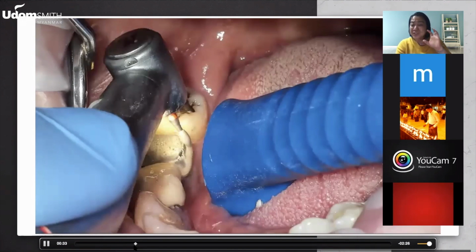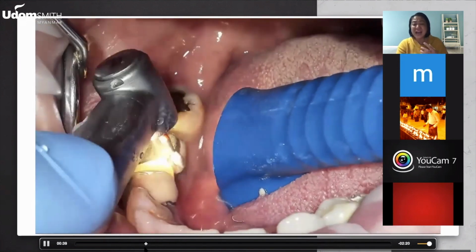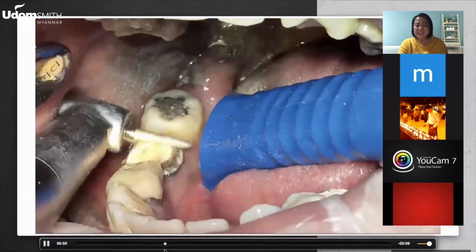So what Dr. Stefan did is they x-ray it, they check if everything is okay, that there is no caries inside, and that the fit is still good. After they checked it, all they did was lower it down around 2 to 2.5 millimeters. As you can see, it is a root canal treated tooth. They lower it down and bevel the cavosurface margin. See? They just bevel it.